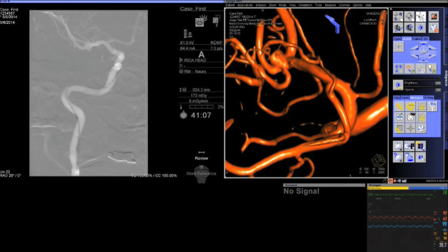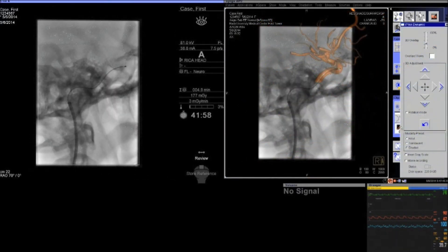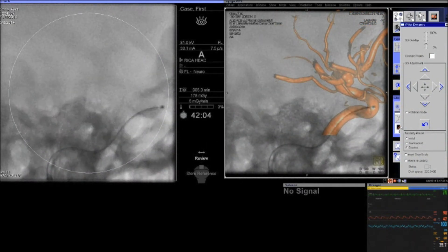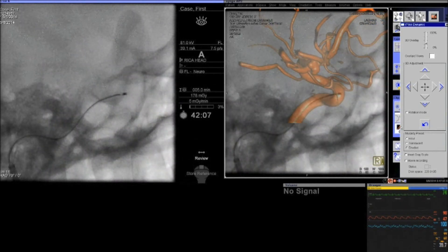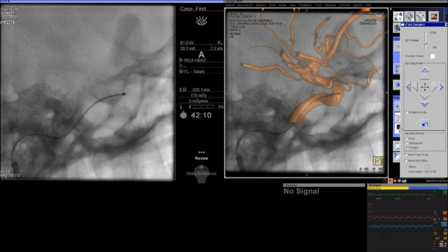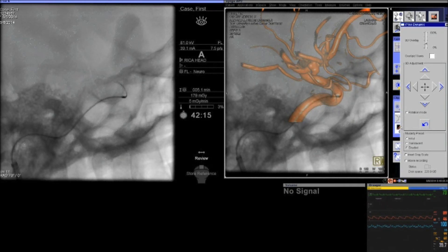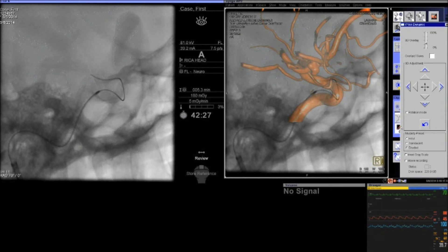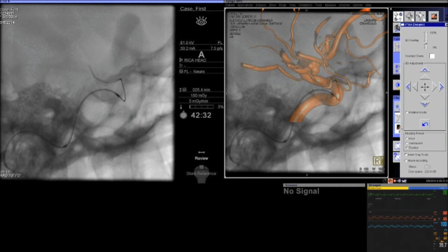The anatomy of this bifurcation has to be clearly defined, and 3D angiography is very important in this assessment. Because of the complexity of this anatomy, we decided to use a ProGreat Plus and a Synchro wire to catheterize. One of the most important tips of this technique is to always catheterize first the most challenging vessel of the bifurcation — in this case, the superior branch of the MCA bifurcation. We also used a 6-French Neuron guide catheter over Select to catheterize the internal carotid artery.